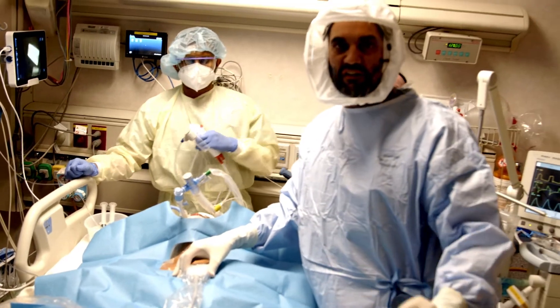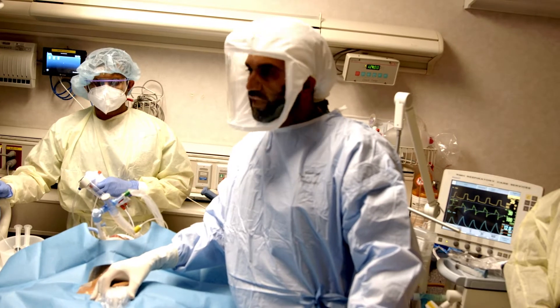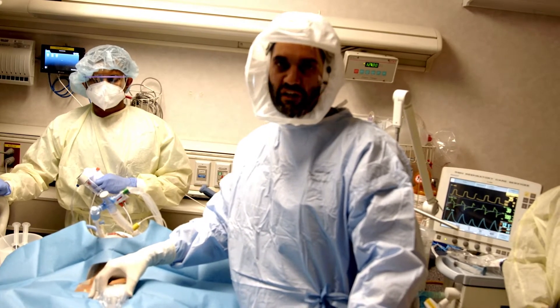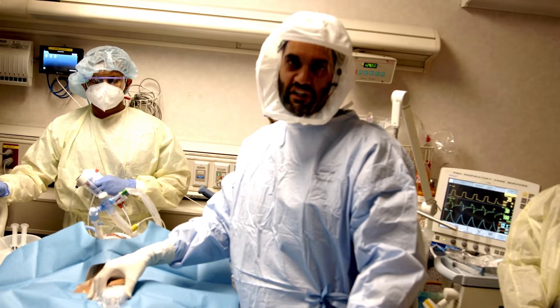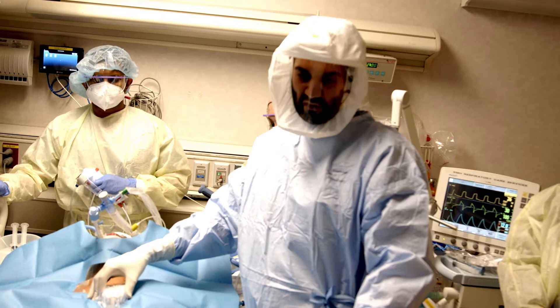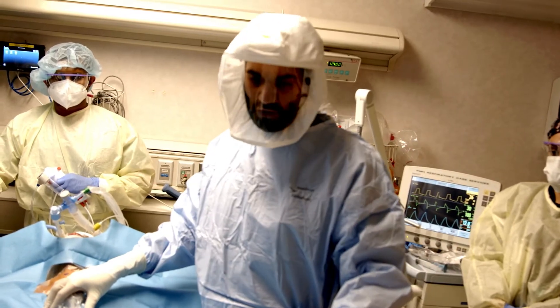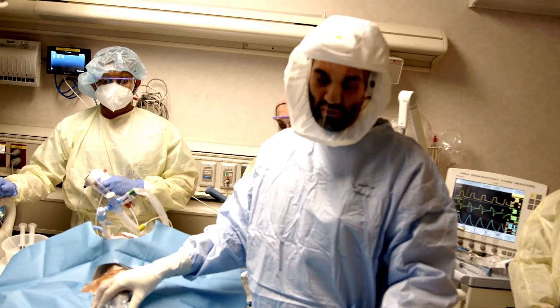Today I'm going to show you how to do ultrasound-guided percutaneous tracheostomy. If you're familiar with the percutaneous tracheostomy approach, this is similar, but I've modified the first couple of steps to use the ultrasound to make it safer, easier, and faster. The setup is the same as the percutaneous approach with the Blue Rhino kit, with the addition of an ultrasound.